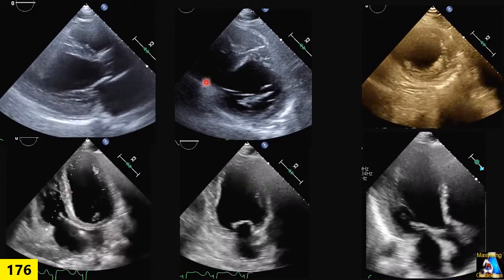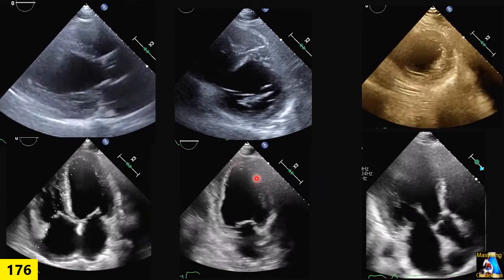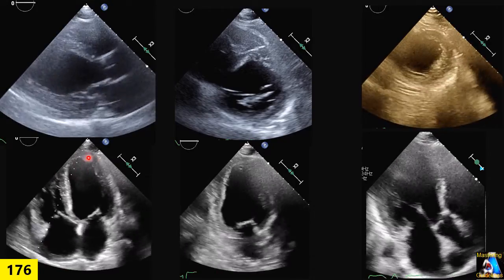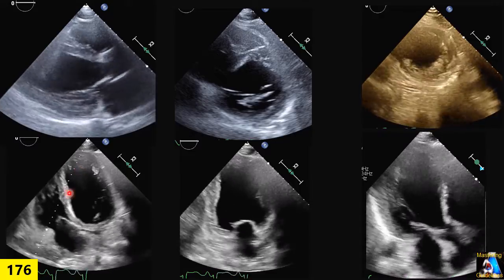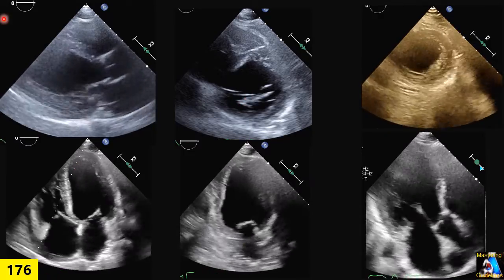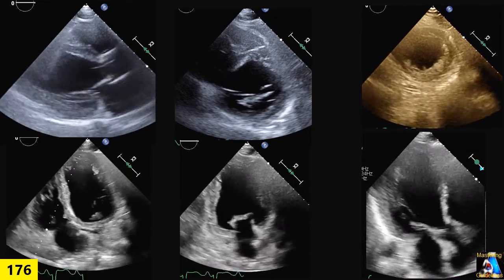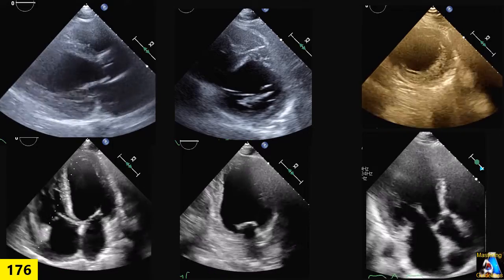Since the tech couldn't visualize some segments — especially the apex anteriorly, apical 3, and there was a near-field artifact to rule out thrombosis — the cardiologist and tech decided to use Definity contrast agent.